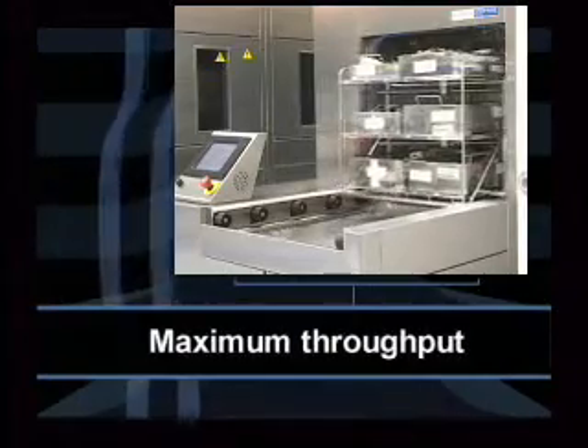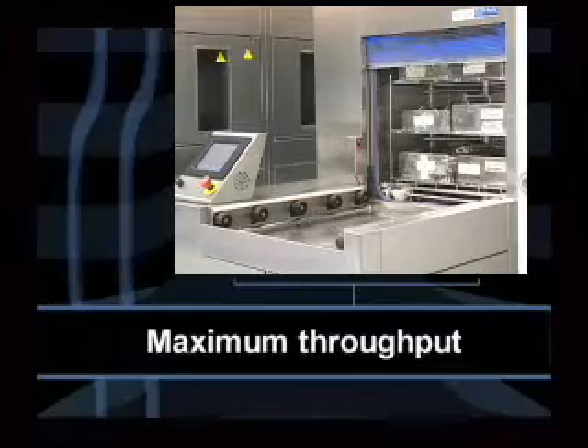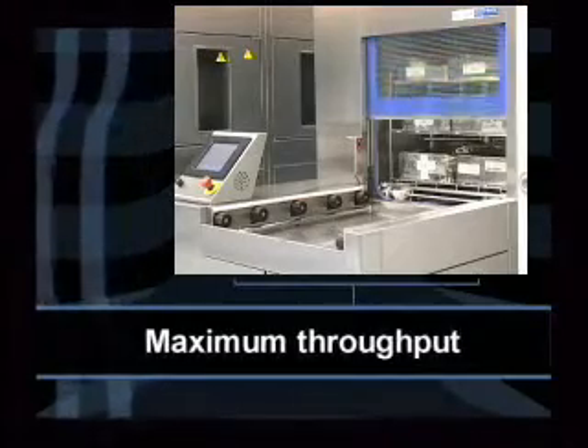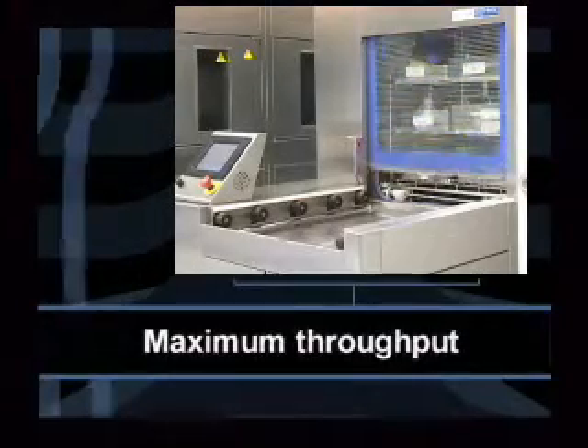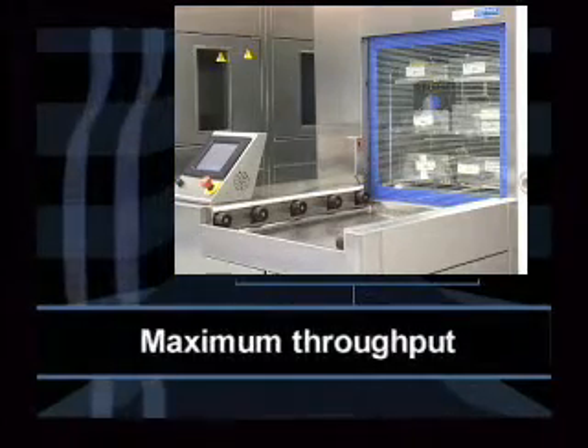The Vision can process manifold racks with up to five levels, processing as many as 10 trays per cycle. Multifunctional washing can be achieved by programming different washing cycles to run consecutively with specific cleaning chemistries for different instruments.